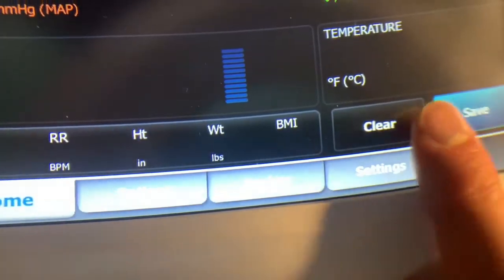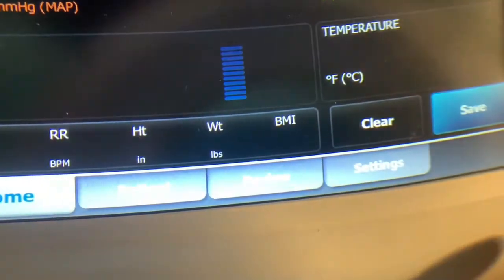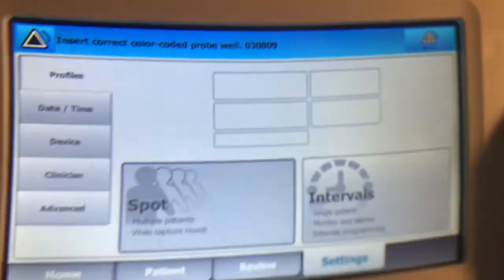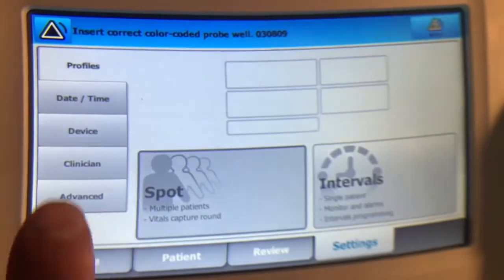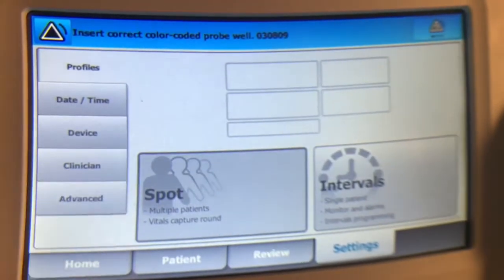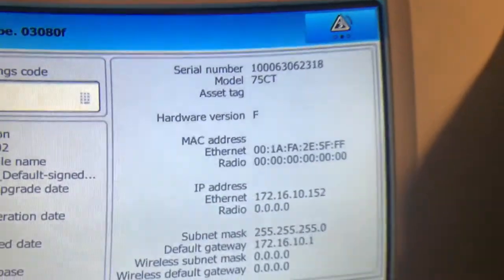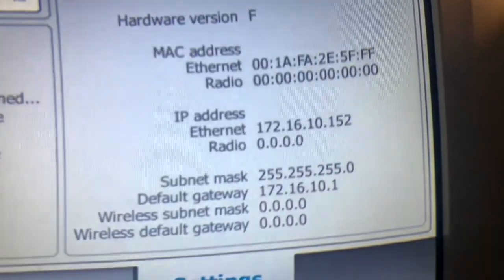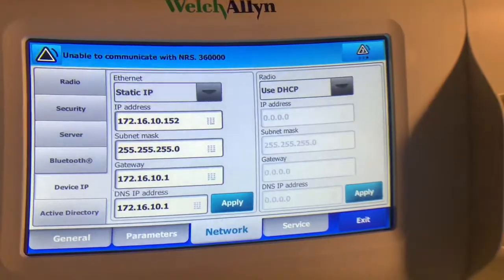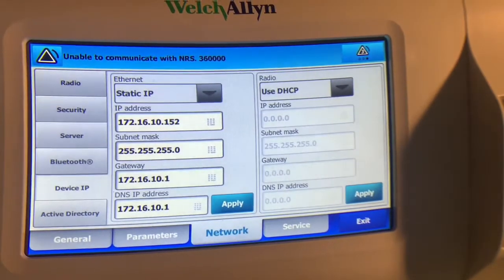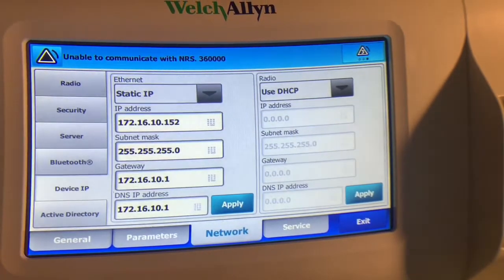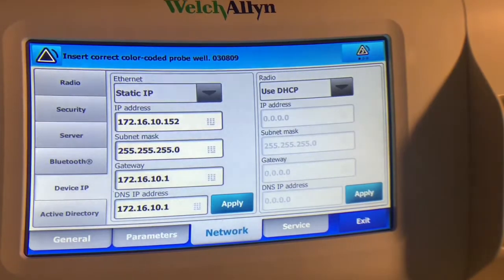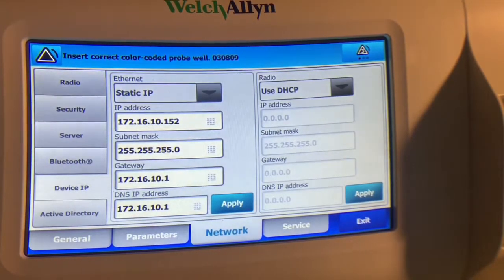We can just go into settings and up here we can go into advanced. Over here is our IP address that we set. But as an alternative, like in the previous videos, we can also use DHCP.